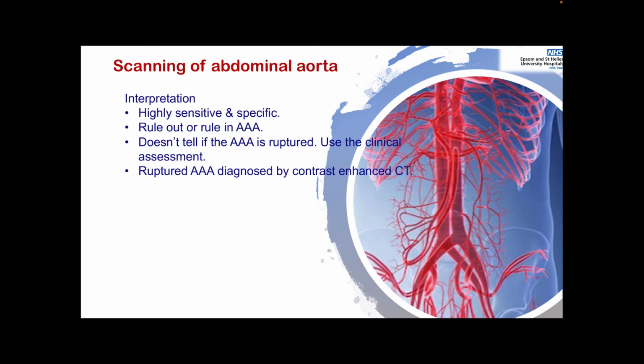Right. How can we do the interpretation? We just let you know that it is highly sensitive and specific. And it is used to rule out or rule in the AAA.